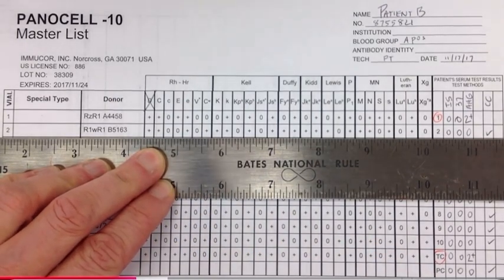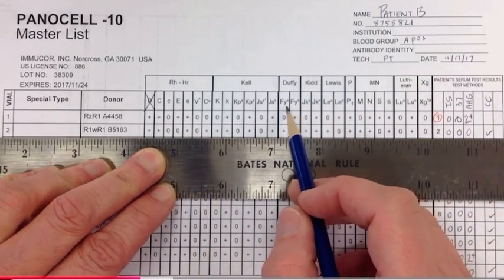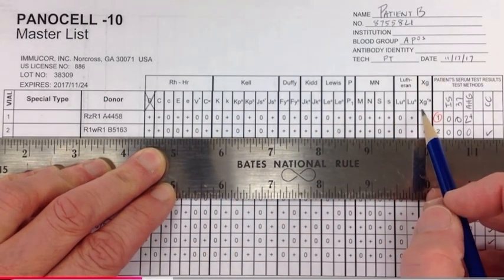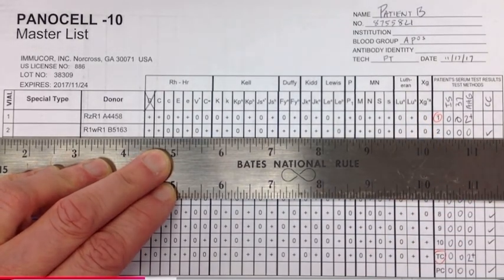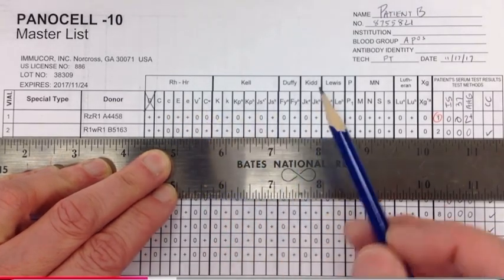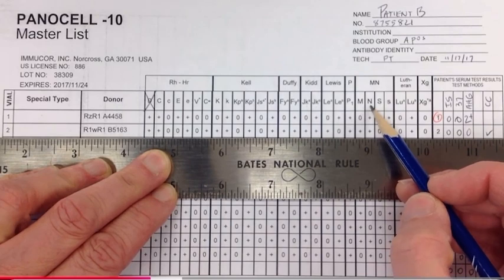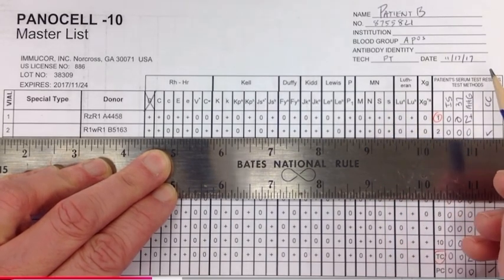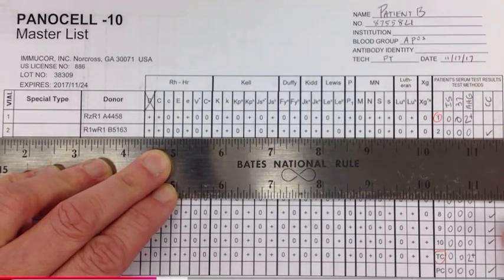Just as I said in my first video, we are going to take a little more conservative approach, that anytime we have a pair like big C, little c, Duffy A, Duffy B, Lutheran A, Lutheran B, we're going to take dosage into consideration. But generally speaking, dosage is probably most pertinent to big C, little c, big E, little e, Duffy A, Duffy B, Kidd A, Kidd B, big M, big N, and big S and little s. The rest of them, even though there are pairs, in blood banking we don't really apply a dosage to them.